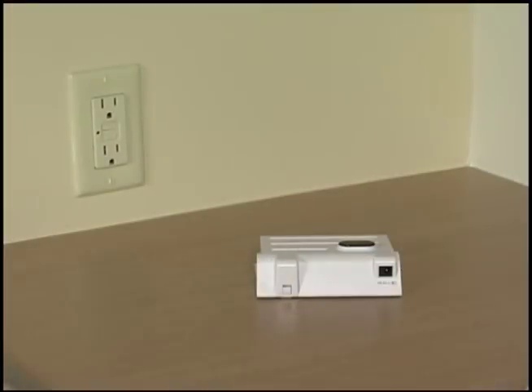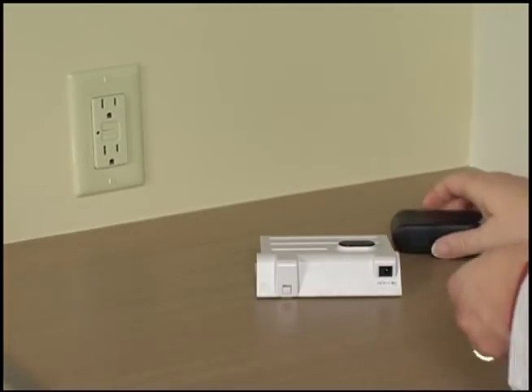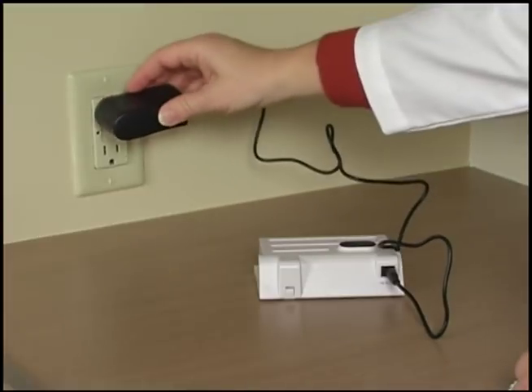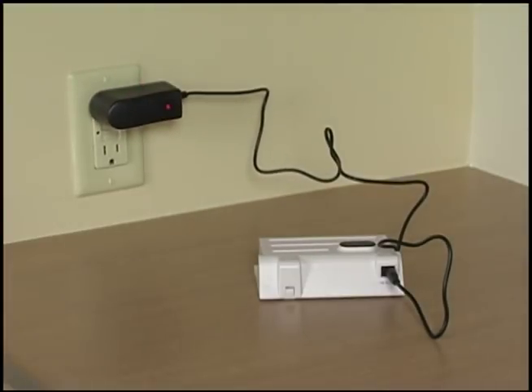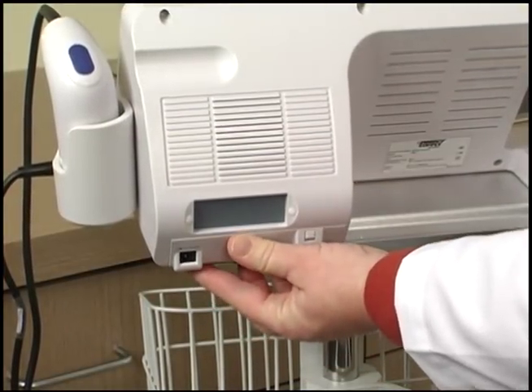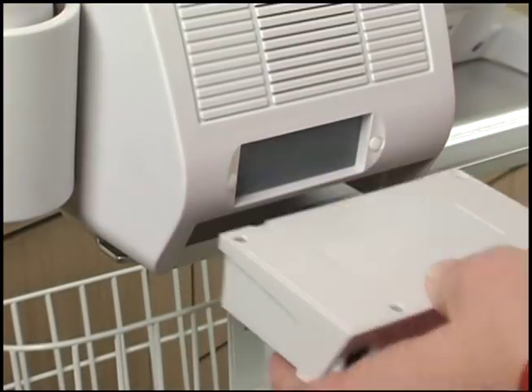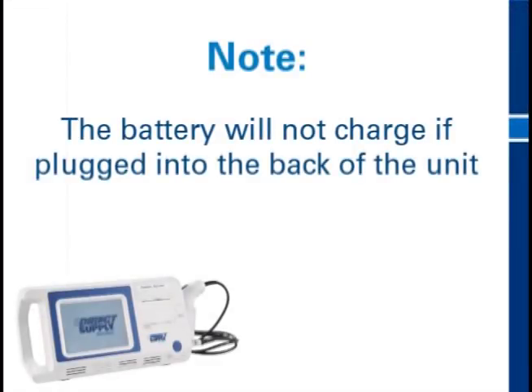The attendant bladder scanner comes with two rechargeable batteries so you can continue to use the device as one battery charges. Connect the battery pack to the charger and plug the charger into an AC outlet. When the charger indicator light is red, the battery is charging. When the light turns green, the battery is fully charged. The battery should then be disconnected from the charger and the charger unplugged. When a battery is fully charged, slide it into place in the back of the unit. To remove a battery for charging, pull the battery tab down while sliding the battery pack out. Note that the battery will not charge if plugged into the bladder scanner unit.